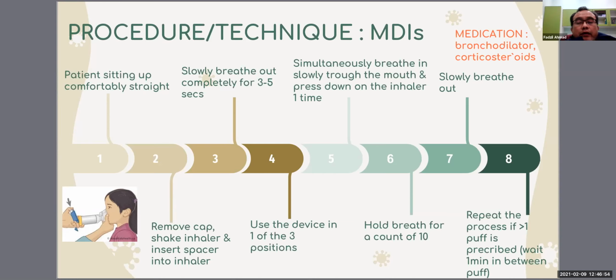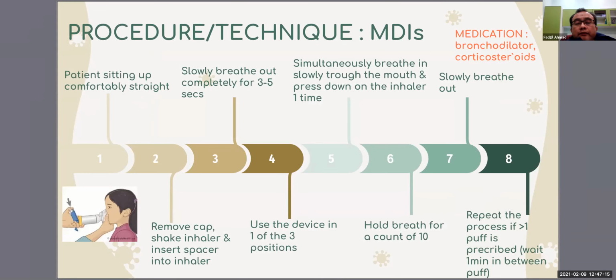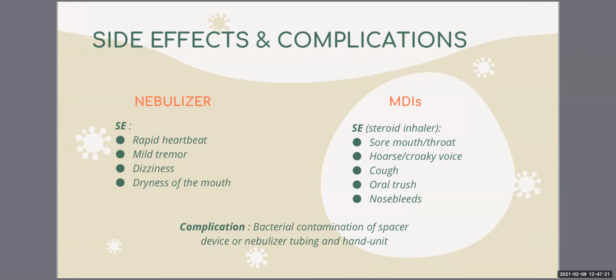And then slowly breathe out, as in our protocol. And then repeat the process if more than one puff is prescribed. And between puffs, wait for 1 minute. No need to wait 1 minute. Okay, no need to wait.